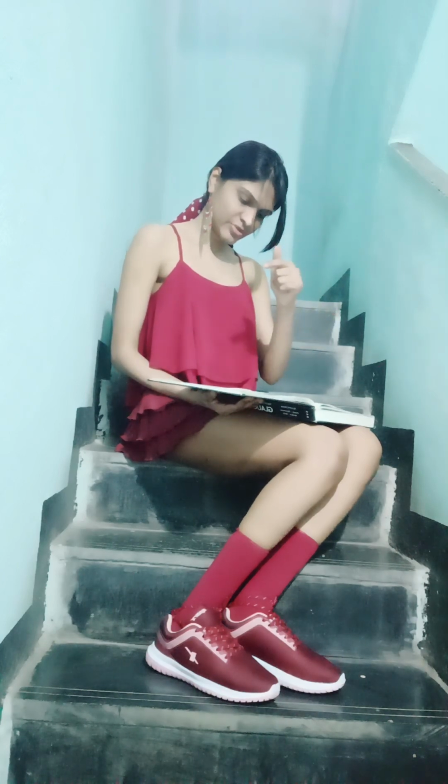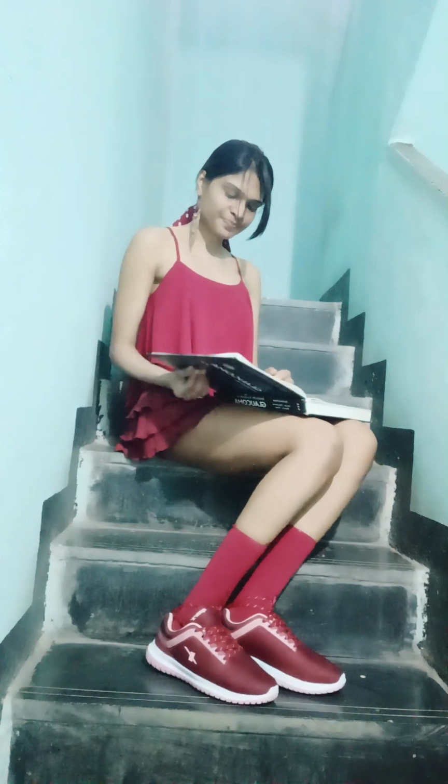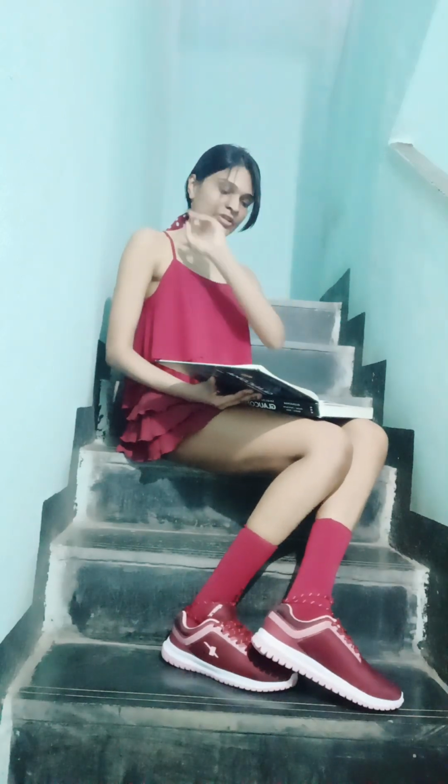Cornea, anterior chamber, angle anatomy, and central portion of the lens to the pupil. This instrument is unable to adequately image the anatomy of the ciliary body or tissue masses behind the iris. Okay, so it's not the most peripheral. It is not capturing the most peripheral structures like the ciliary body and the root of the iris and the tumors behind the ciliary body or the root of the iris.